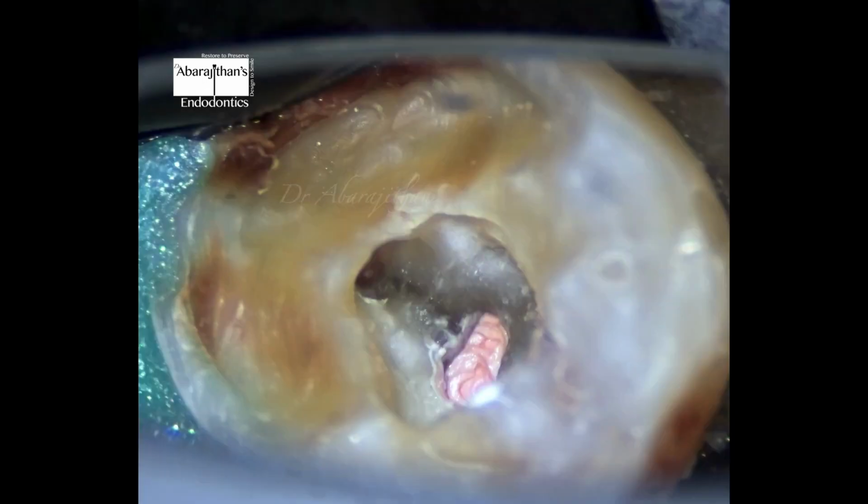So we again finish the case with bioceramic obturation. You can also see that in this case, in the disto-proximal gingival seat, we left behind some caries intentionally during the initial part of my treatment, so that my rubber dam sheet is not torn or my isolation is not affected during my endodontic treatment.